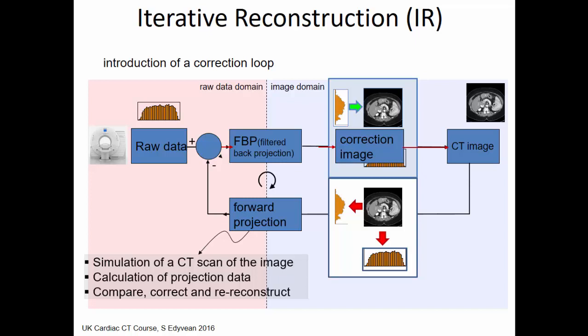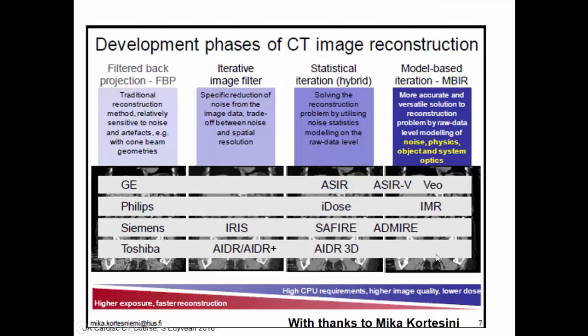And this is using more of the information, and as I said, it's a whole topic in itself. This slide just shows you that each manufacturer has a number of different methods, and some of these methods on the right, which is so-called model-based iteration, are very computer intensive, but they give you much better results in many ways.